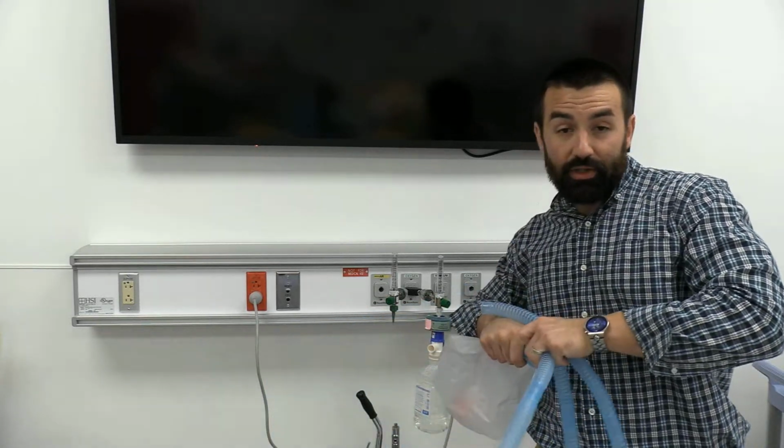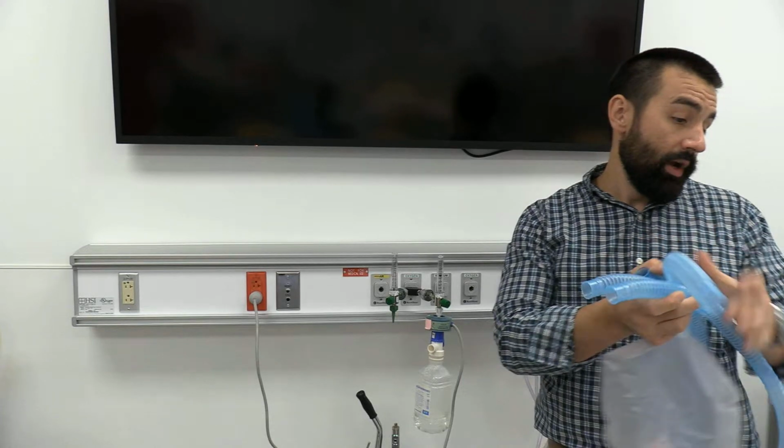Okay, so let's talk about some other situations in which you would want to add heat. If you have a tracheostomy tube, we automatically have to add heat. So always add in heat for a T-piece or a trach collar. All right, so that's always something you need to keep in mind.